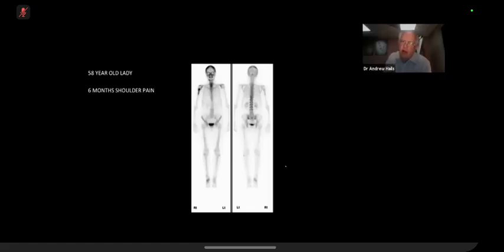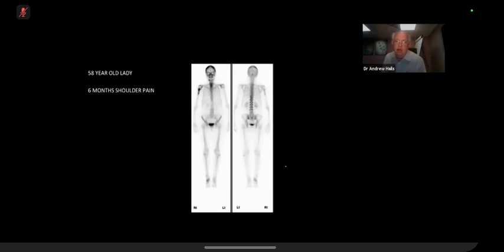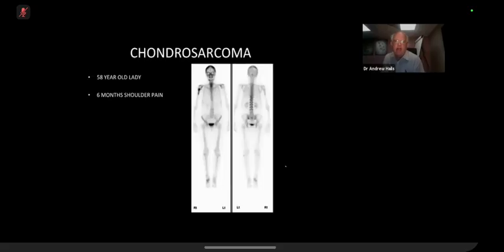Yeah, okay, well, I'll hurry on a bit because I've been told we need to hurry on a bit. But basically, we thought this was benign, but we were wrong. And I think the point is the patient had really definite pain there. And in fact, that's what it turned out to be.